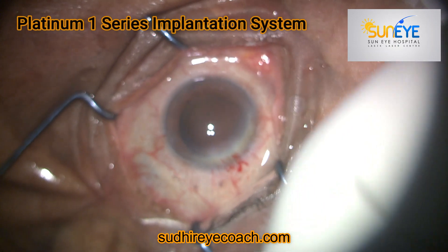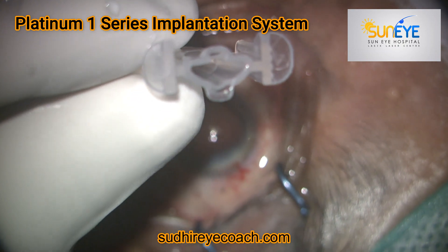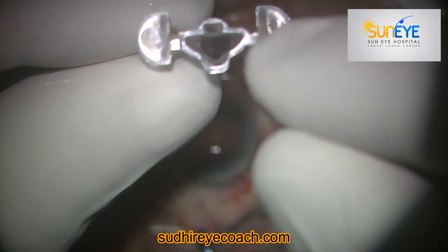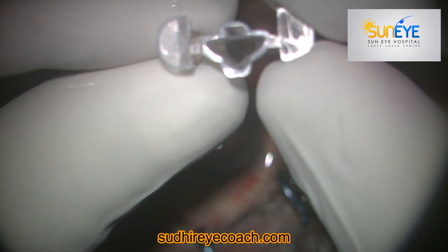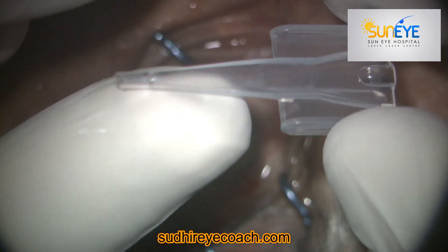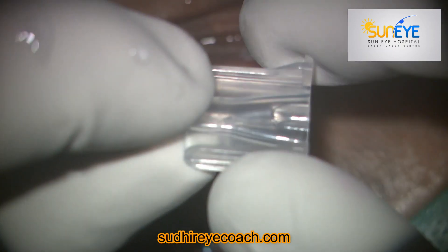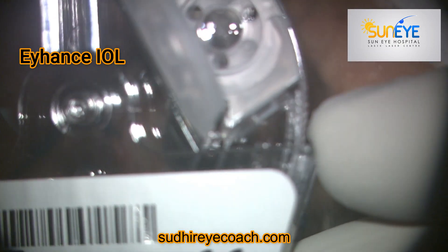This is the Platinum Series 1 cartridge. You can see there is a hollow space through which we implant the lens, and there is a hump on the lower side which addresses the site of the plunger. The plunger comes through and pushes the IOL. It has an IOL mark on the surface, and the tip is a beveled-down tip that exactly fits in the clear corneal wound, allowing implantation through the no-contact technique.